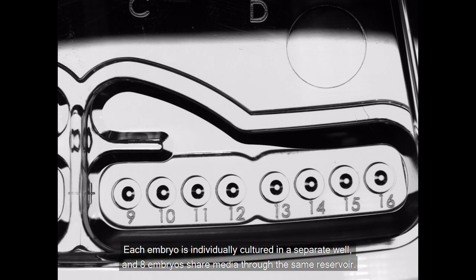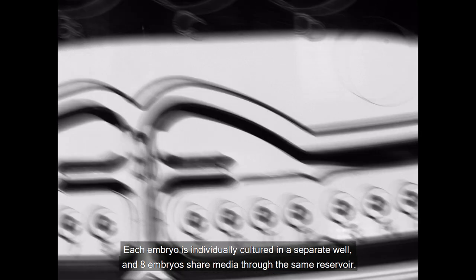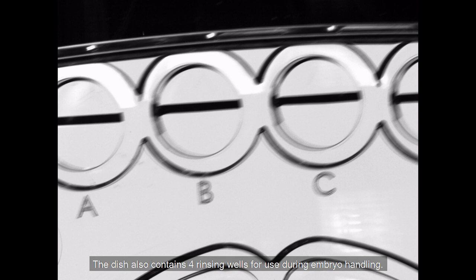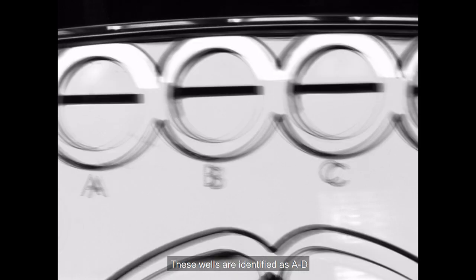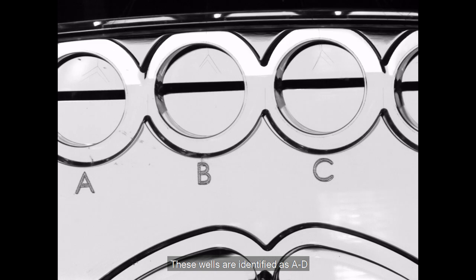Each embryo is individually cultured in a separate well, and 8 embryos share media through the same reservoir. The dish also contains four rinsing wells for use during embryo handling. These wells are identified as A to D.